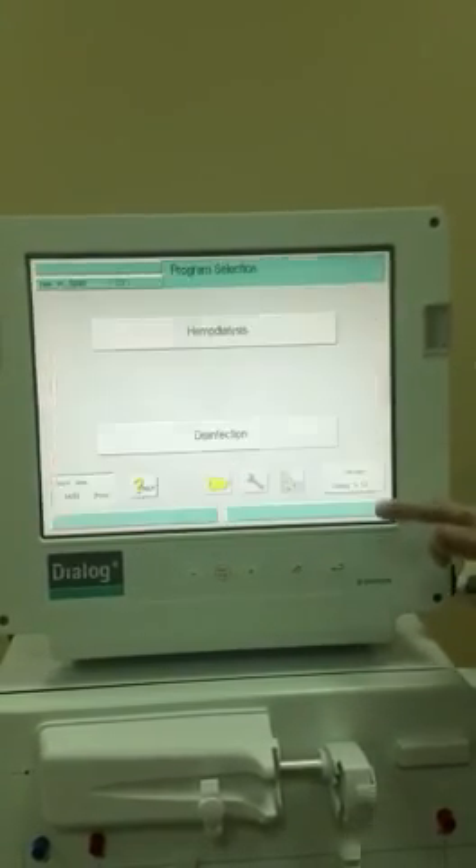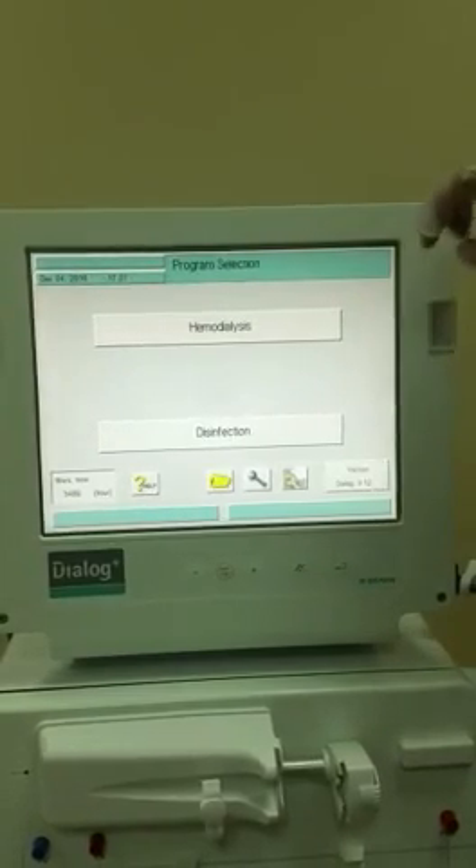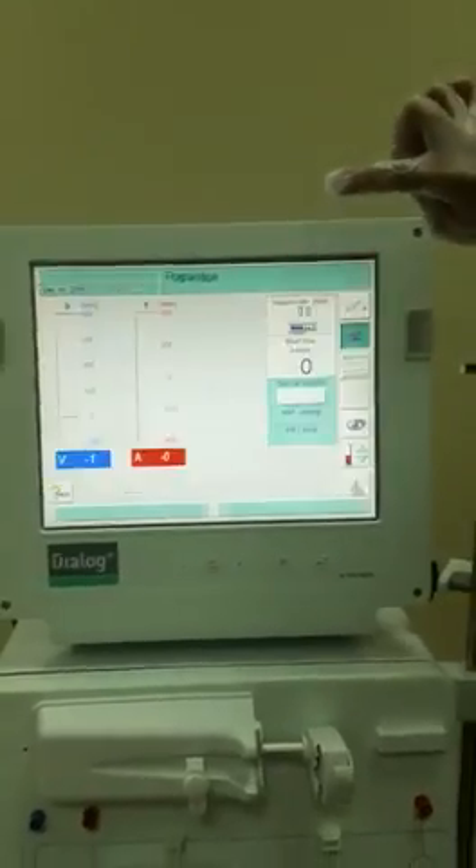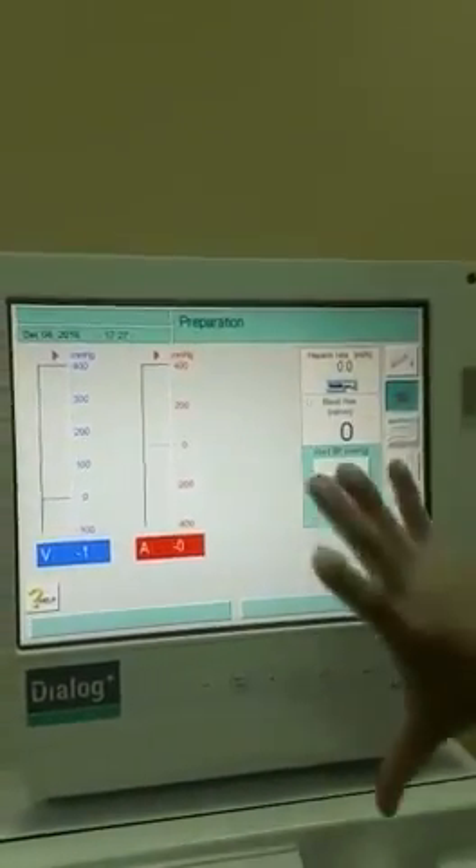We'll press the back button, then we will see the program selection. We'll press hemodialysis, then the preparation page will appear.